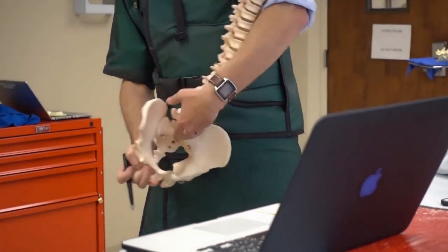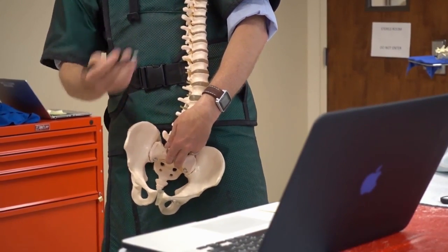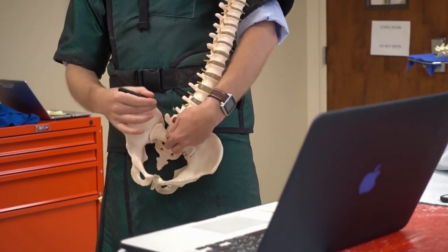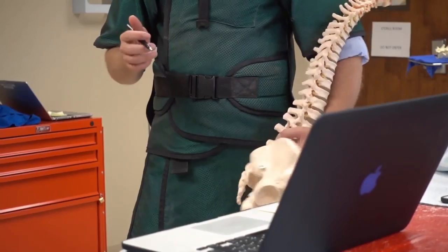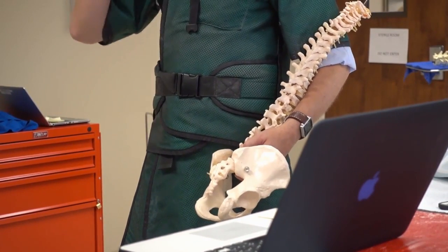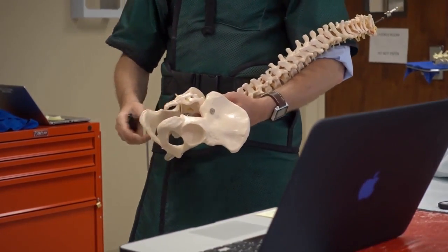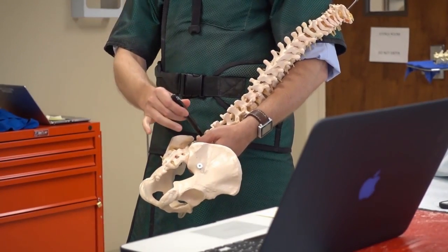And that's why a transforaminal works a little better for a pinched nerve in the side. When we have a pinched nerve, say from a herniated disc, it's always going to be pressing the nerve root from the front. It's never coming from the back pressing in. So the closer we are to the pathology, the better. But sometimes, and especially it seems with spinal stenosis, an interlaminar epidural works even better than a transforaminal. So the idea is that instead of coming from the side, we're going to come literally from top down.